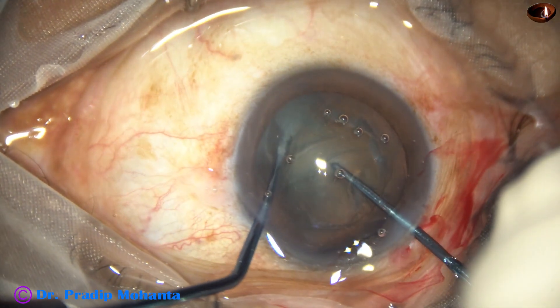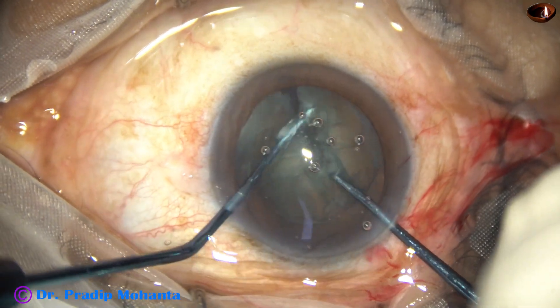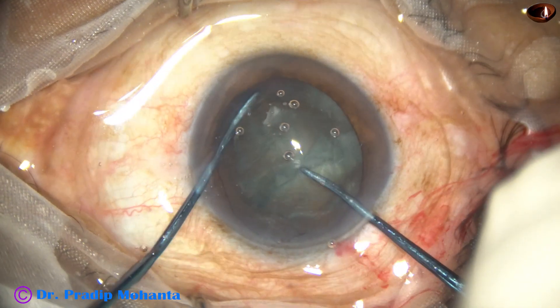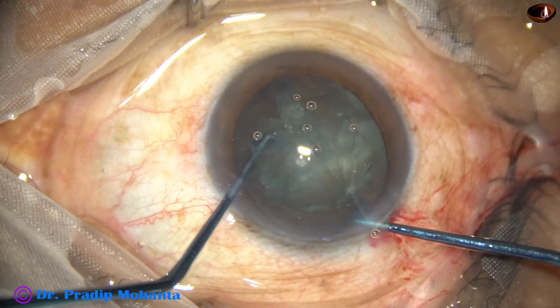The sustainer hooks the opposite equator. The two instruments come to each other and lateral separation is done. The nucleus is rotated, one hemi nucleus is subdivided into two pieces, and the two instruments are taken out.